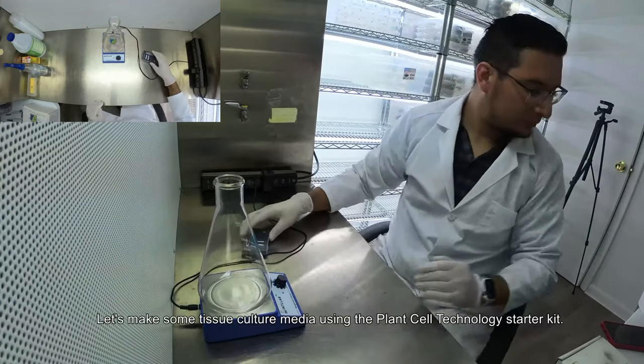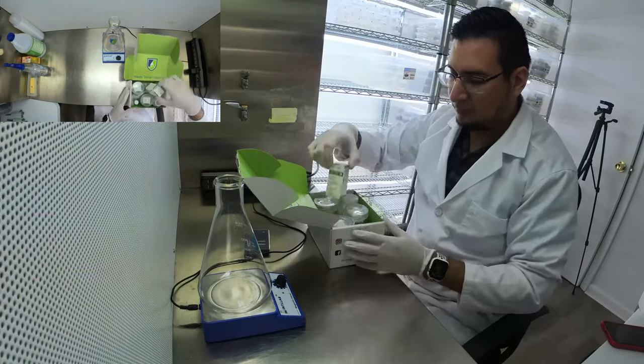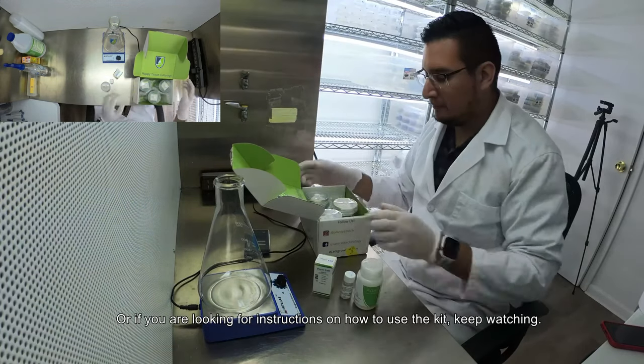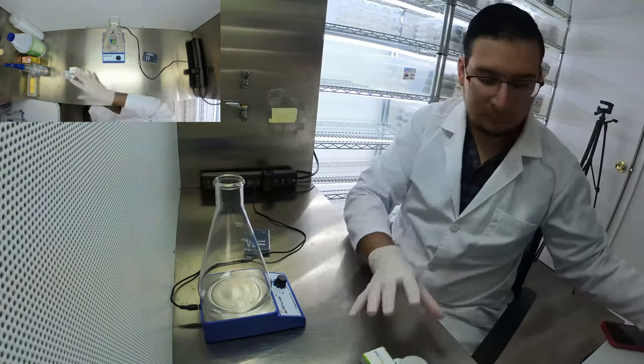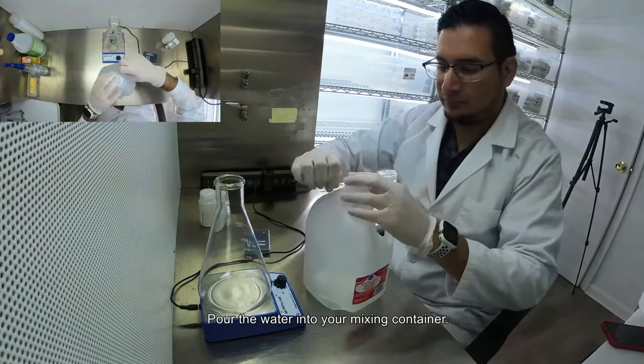What is going on guys! Let's make some tissue culture media using the Plant Cell Technology starting kit. If you are thinking about getting this kit, I already made an unboxing video. If you are looking for instructions on how to use the kit, keep watching. You will need sterile or RO water — pour the water into your mixing container.